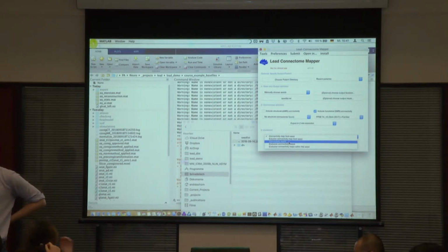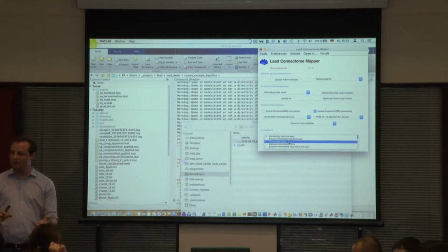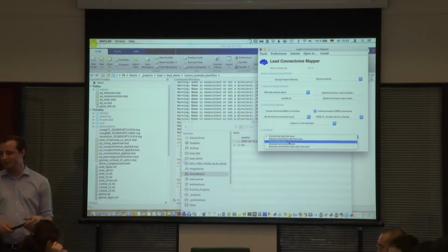That's the problem with patient-specific data in fMRI, especially: if you scan the patient twice or 3 times, it varies a lot. It often varies more than the UPDRS score will. But I'd say that the strength of the normative connectomes is that you use an atlas that is more or less robust and doesn't change, and the only parameter that you change is the VTA placement. And of course, the downside is that it doesn't reflect anything about the patient-specific connectivity. And the connectivity strength would not be very informative in that context.